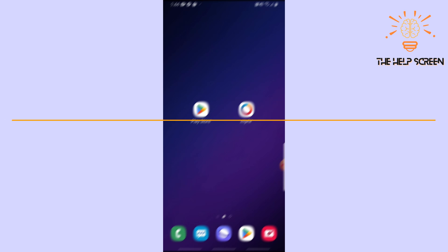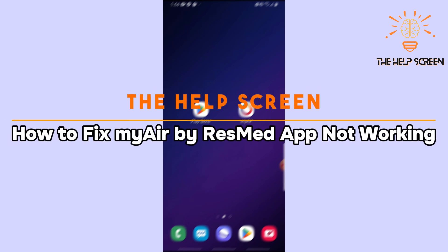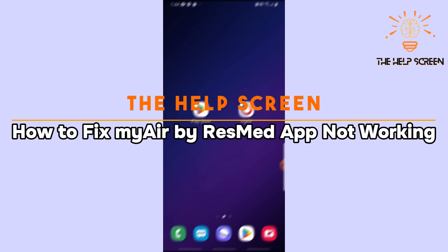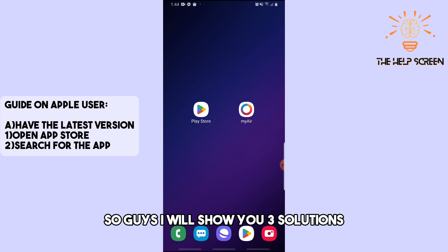Hey guys, welcome to the Help Screen. This is how to fix the MyAir ResMed app not working. This is an Android and Apple device tutorial, so follow along. I will show you three solutions.